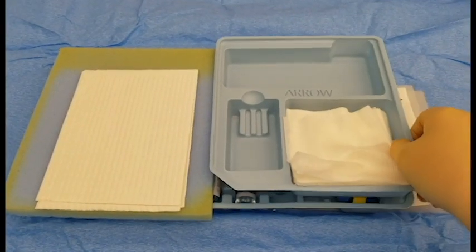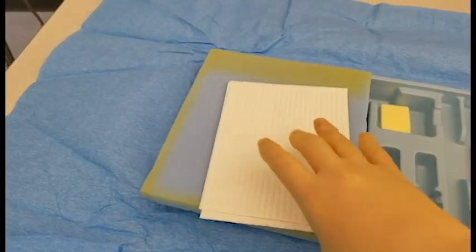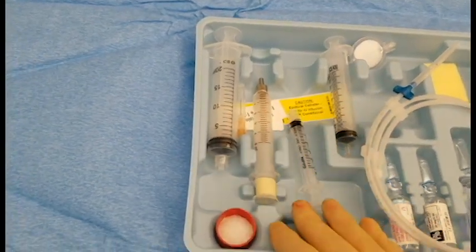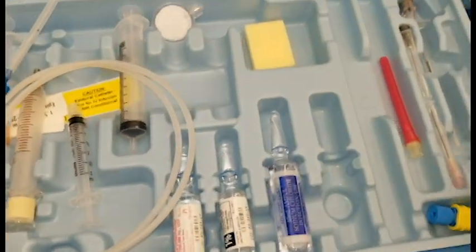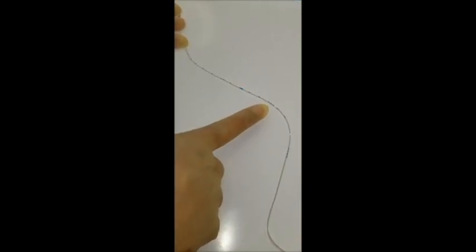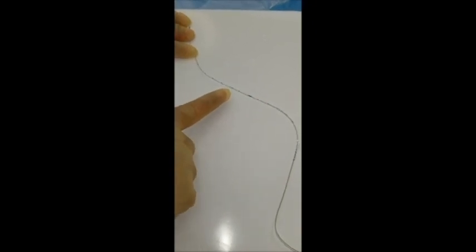Here are the contents of an epidural tray. It will contain 1% lidocaine for skin numbing, your test dose, your epidural catheter, loss of resistance syringe, Tuohy needle, labels. Here is the epidural catheter. 4 lines equal 20 centimeters, 3 lines 15 centimeters, solid line 12.5, double line 10 centimeters.